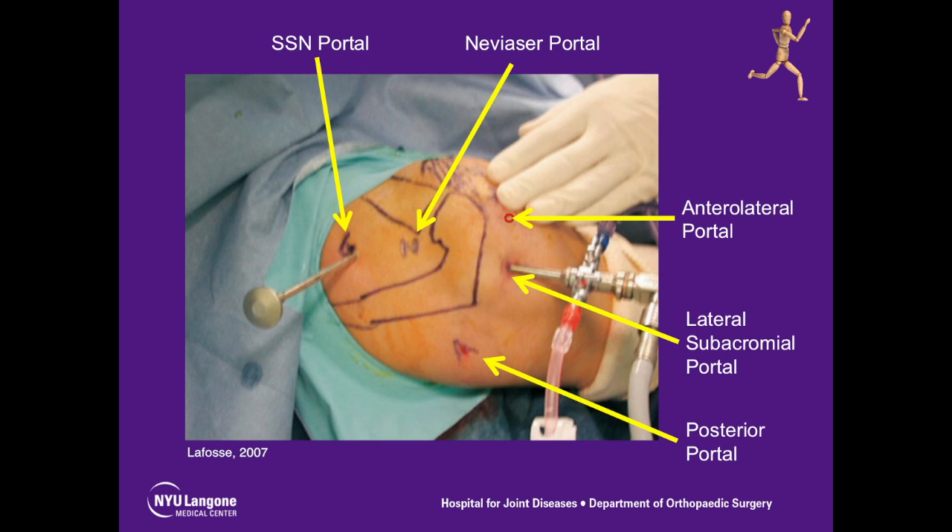We utilized the beach chair position and basically five portals. The standard posterior portal is used for glenohumeral visualization. We use a lateral subacromial portal for visualization, the anterolateral portal for instrumentation and shaving, the Navisier portal to transect the ligament, and the suprascapular nerve portal to aid in visualization of the nerve and the transverse scapular ligament.